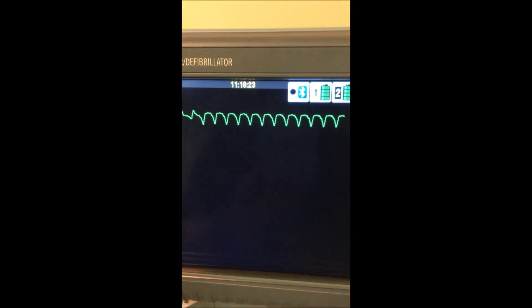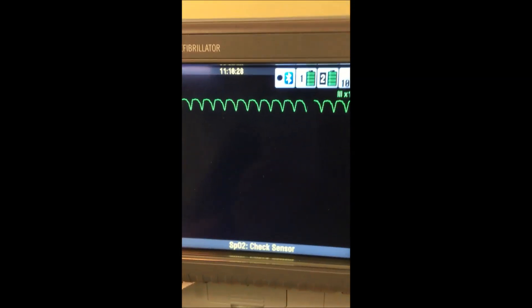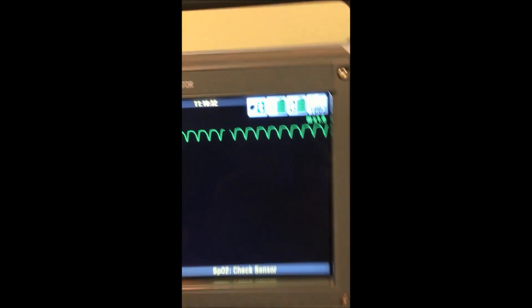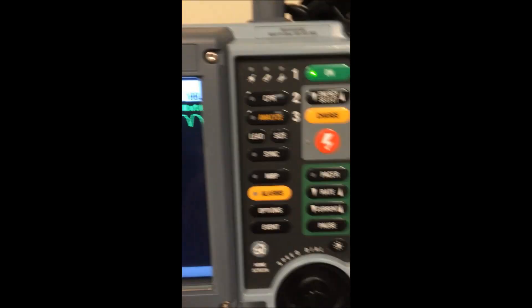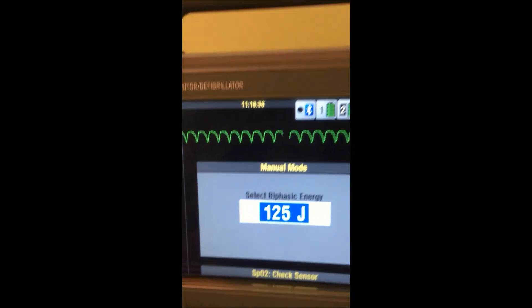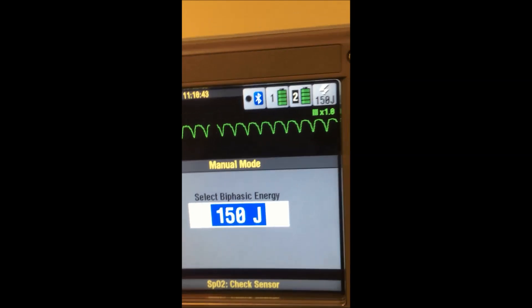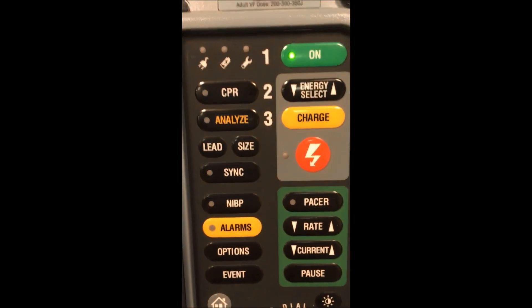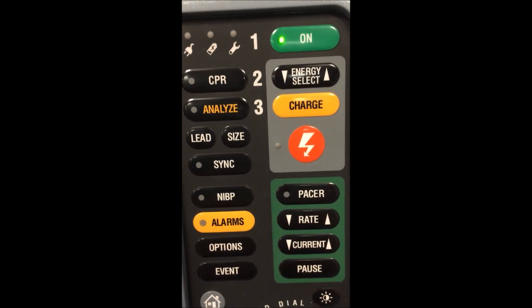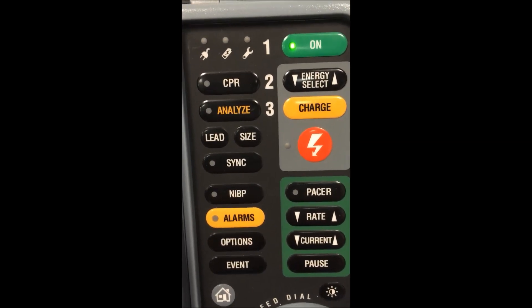Our patient did not convert — he's still in V-tach. So what we would have to do, if he still had a pulse and was still in the same situation, is increase our energy level. Let's go up to 150 for no particular reason. What you'll notice is that as soon as I fired that charge, the sync switch turned off. So each synchronized cardioversion you do, you have to repress the sync switch.